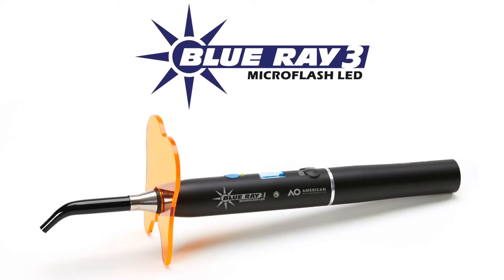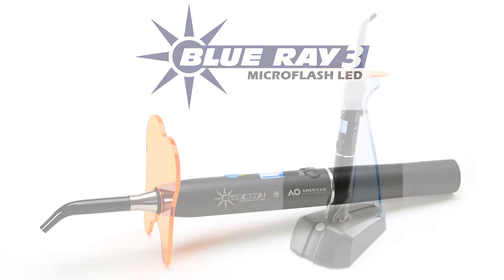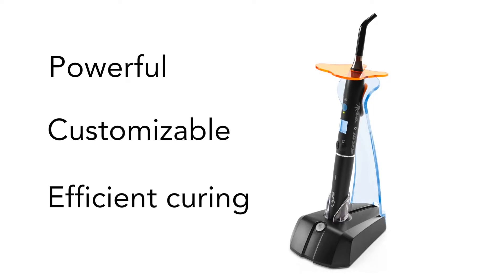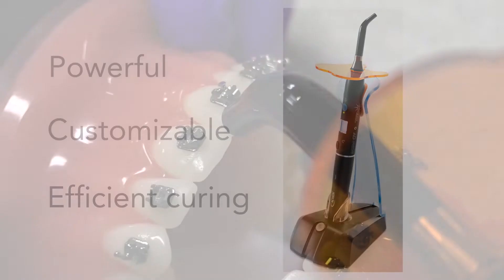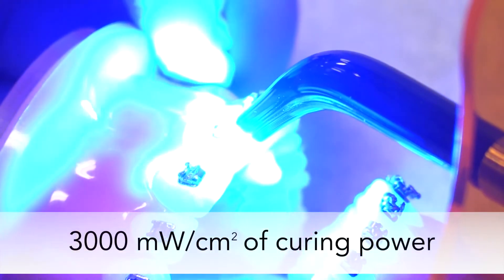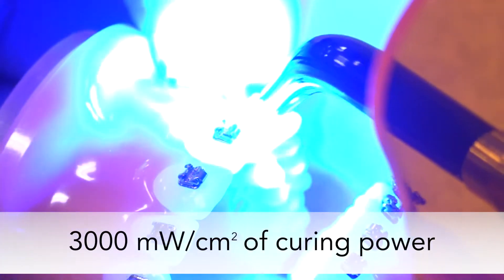Blu-ray 3 is the original orthodontist curing light, manufactured with strictly the orthodontist's needs in mind. Blu-ray 3 is powerful, customizable, and provides efficient, dependable curing every time. Blu-ray 3 delivers up to 3,000 mW per centimeter squared of curing power, making it one of the most powerful lights in the industry.